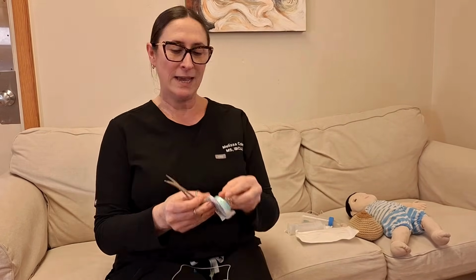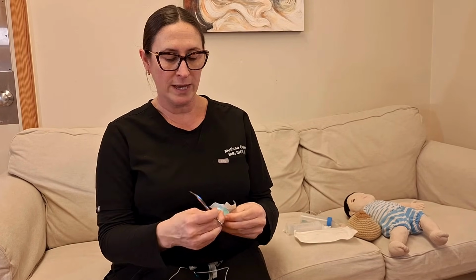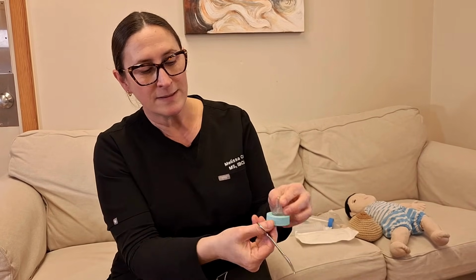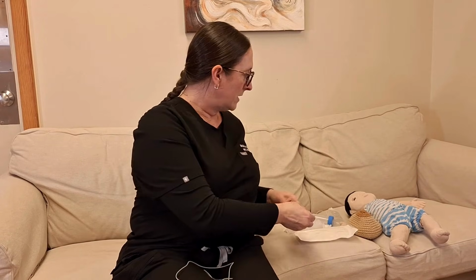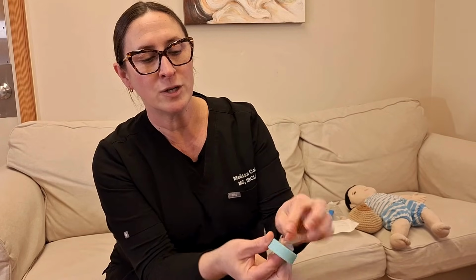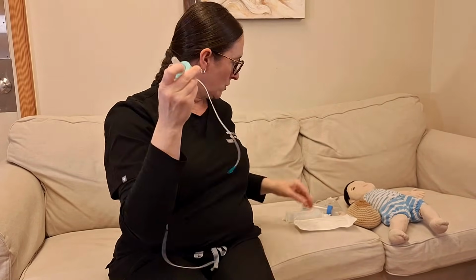This will be our baby straw. Then I'll just take a nipple that we usually don't care about, maybe a bottle that you're okay to sacrifice or a disposable nipple. I usually make a little slit in the side of it. And now honestly, we're mostly done. So I'm just going to feed our tube through the little side. Okay, now we have our baby straw.